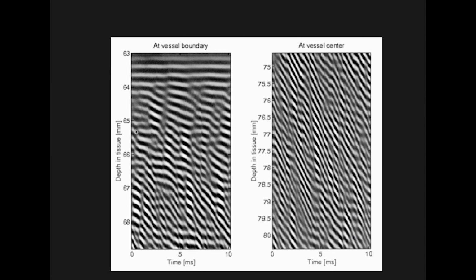So what we see here now is like an M mode, of consecutive pulses being sent out. Here, this is in the direction of the scan line, and this is as a function of time. You have to imagine this image here on the right below this image. So just split, but it goes lower.